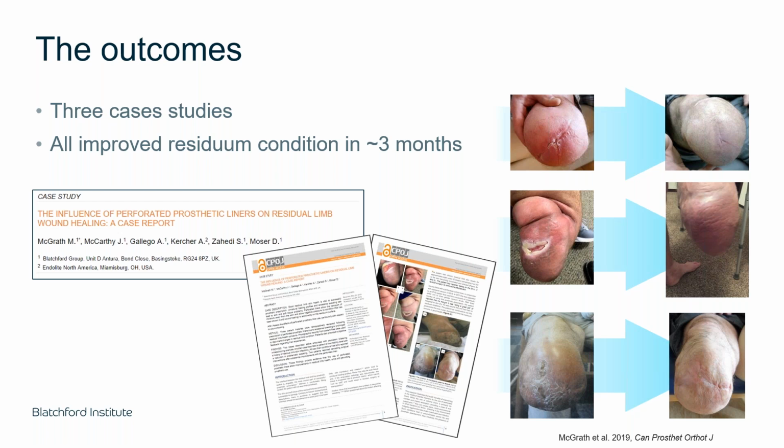It'll take a couple of steps to get that vacuum up to a reasonable level, but people can normally feel it within literally 3 or 4 steps. They'll start to feel, hang on, that vacuum's starting to crank up already. It might take significantly longer to get to 13, 14 inches, but people do feel that vacuum pretty well immediately.